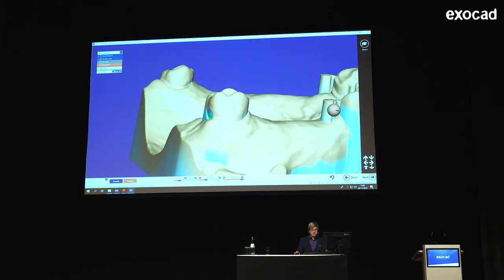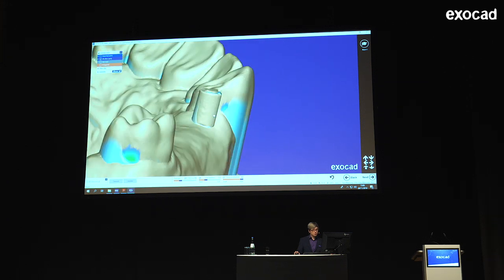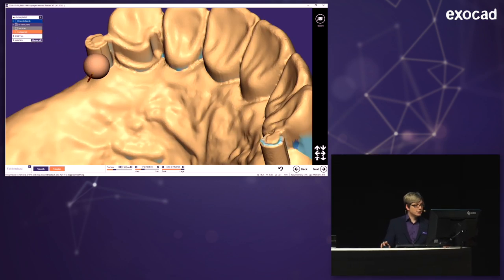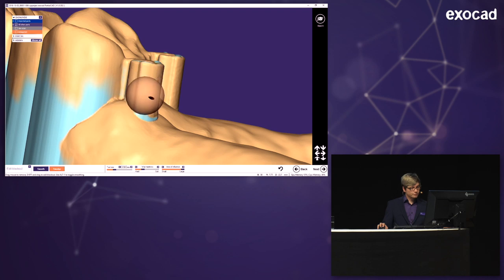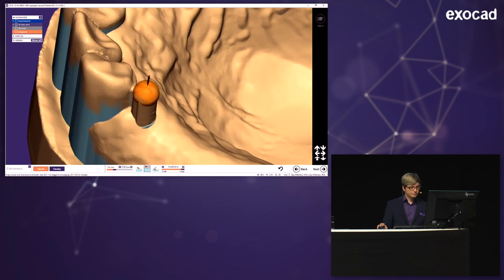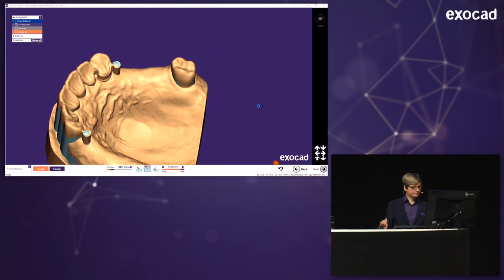And also, the attachments themselves, because I added a blockout angle of 1 degree, those are as well blocked out by 1 degree, but you wouldn't want that. So I'm just taking all of this away. The tool is actually a really crude smudging of the wax. And afterwards, for a better fit and easier handling for the patient, I can down here use the smooth and add some material up on the attachments. So in the end, it will fit better. So that's it for that. And I'm going to the next step again.